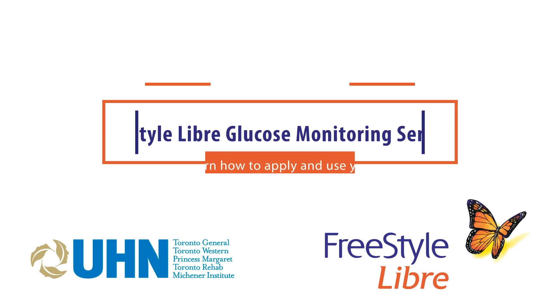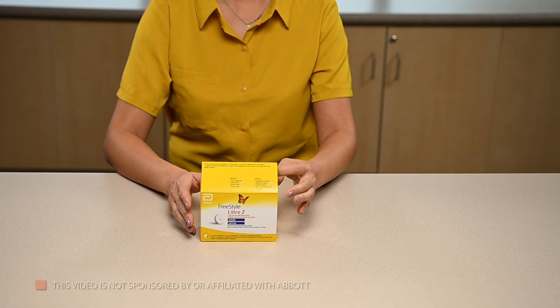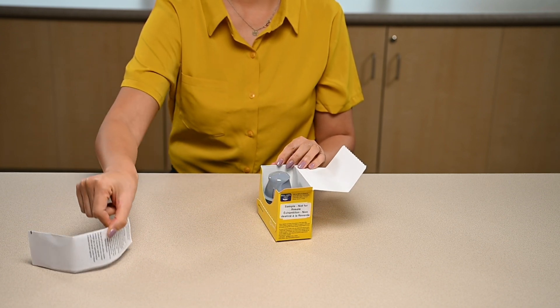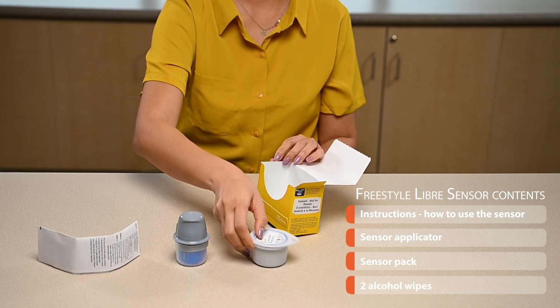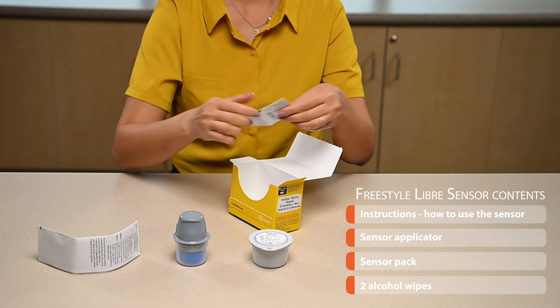This video will teach you how to apply and start using the Freestyle Libre continuous glucose monitoring sensor. Open the sensor box and lay the supplies out on a table. Inside the box you will find instructions, the sensor applicator, the sensor pack, and two alcohol wipes.